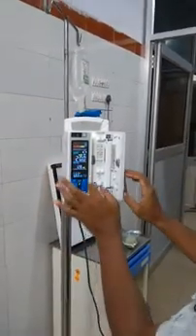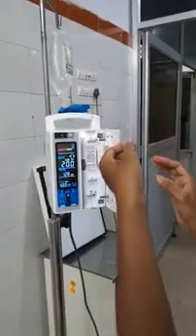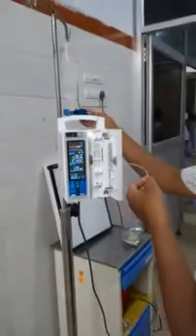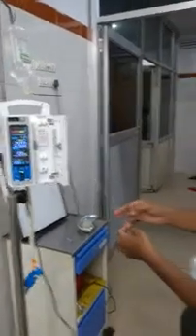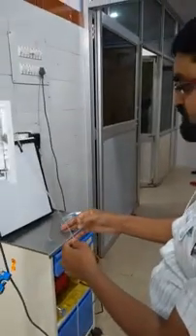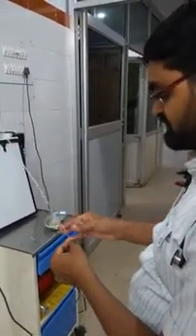Okay, so door open alarm is there, and I can visually inspect for the air. Okay, so I can see an air column here. The best thing I can do to avoid the wastage of the drug is to remove this from the drop sensor. I have placed it down, and then I will just pull it and tap it, and you can see the air bubbles slowly breaking into small micro drops and moving up, right?